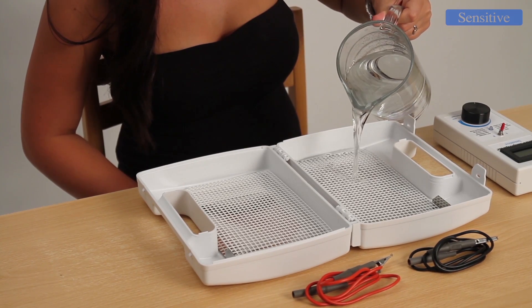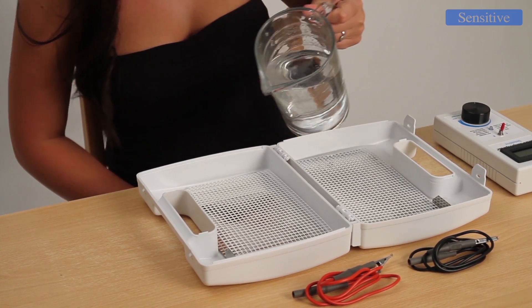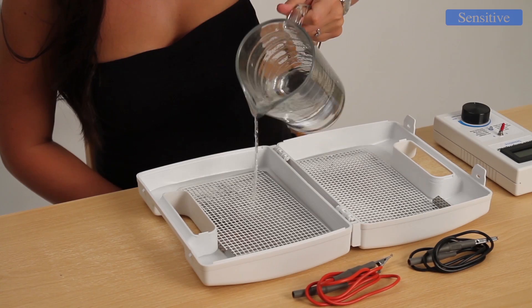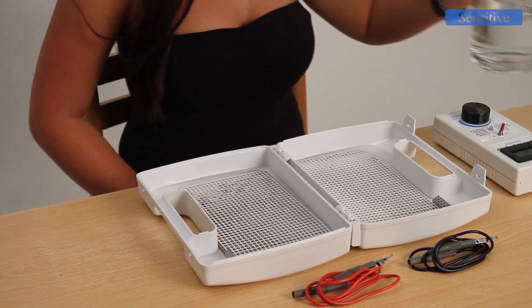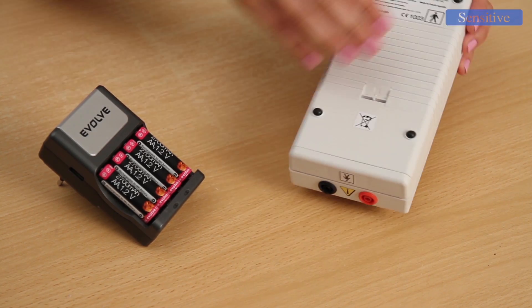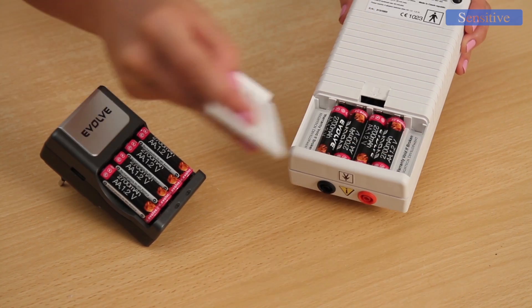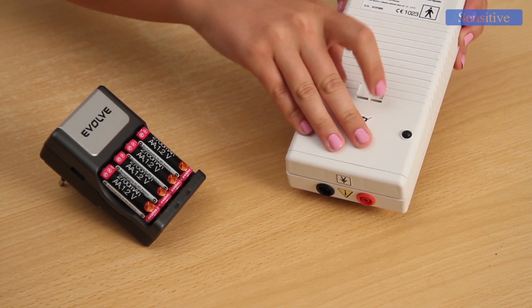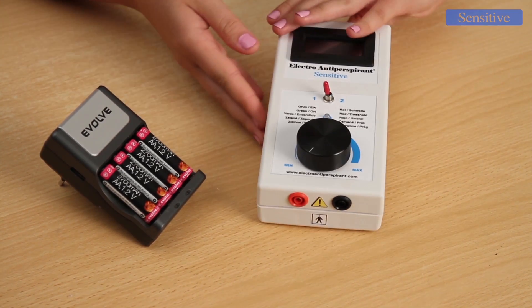During therapy, regular tap water — warm if possible — is used. You pour it into the prepared containers that are part of the basic package. Operation of the device is provided by four AA batteries or their rechargeable version, which minimizes the cost of therapy and allows operation of the equipment in any home, while guaranteeing safety.